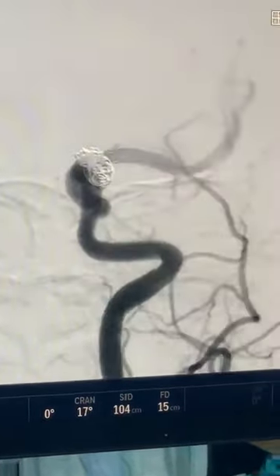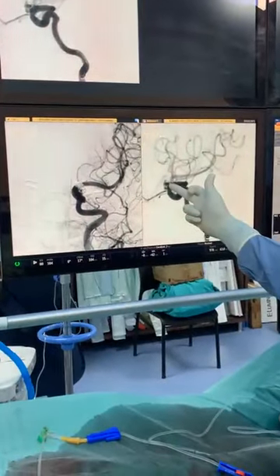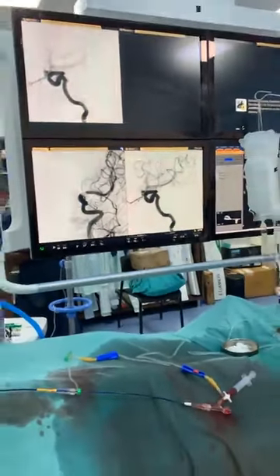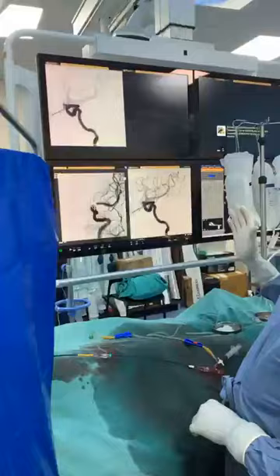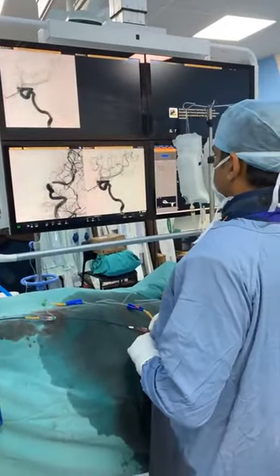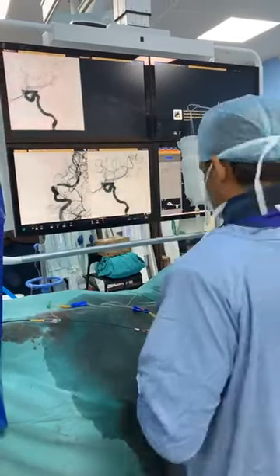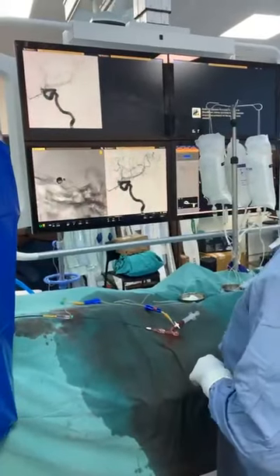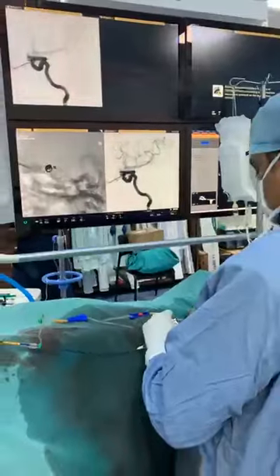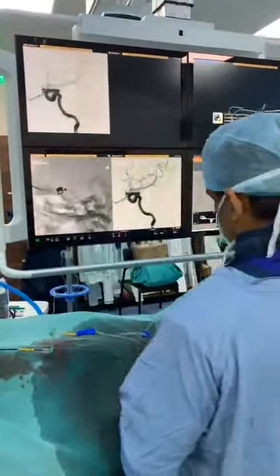Yes, so we go back to this angle. Earlier, you see this aneurysm filling over here, and we will compare what we see now. Can we go to earlier? So this is the initial angiogram at 5:38 p.m. where we can see the recurrence into the aneurysm. And flow diverter takes time, but for us to understand what is the situation we are in, we can take a similar, comparable run and see what's happening.